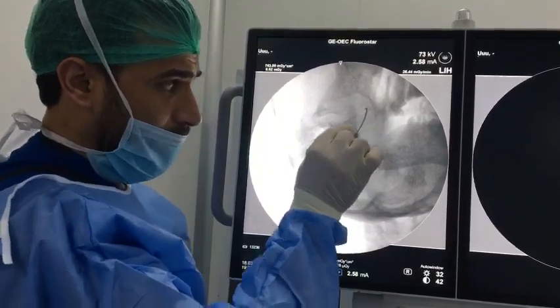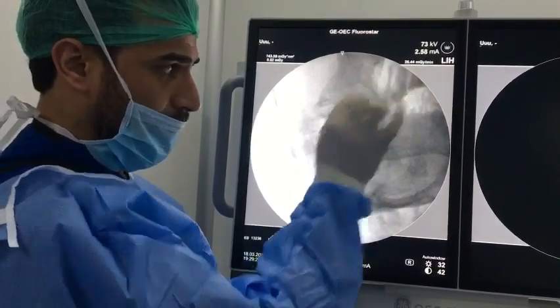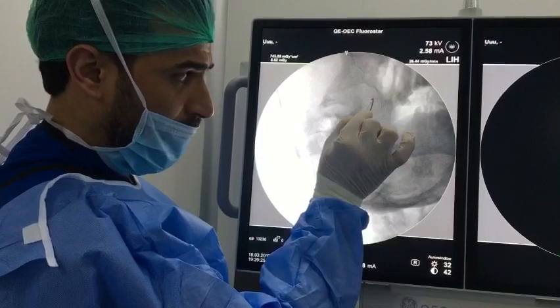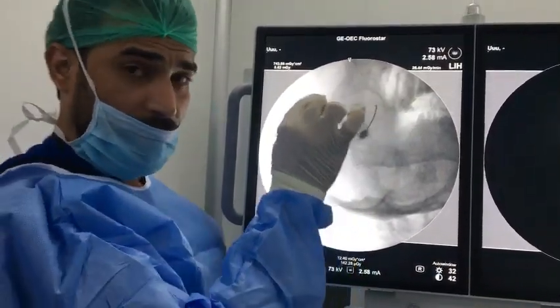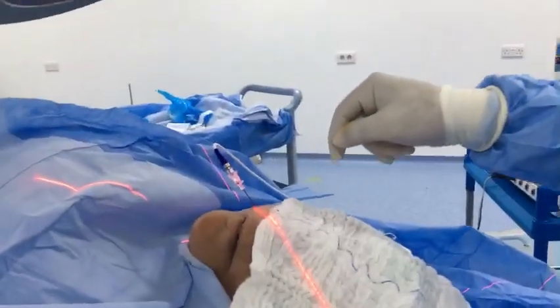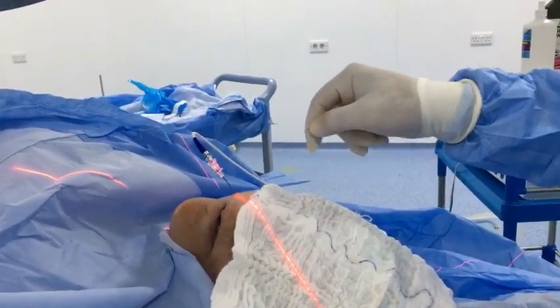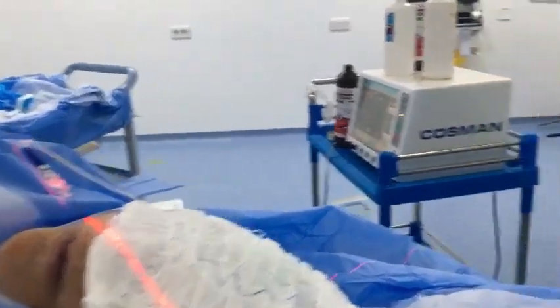See here — this round oval shape, this is the foramen ovale. See the needle: I kept the tip of the needle just inside the foramen ovale. The tip of the RF needle is inside. Here is the lower trunk of the trigeminal ganglion with the mandibular branch, maxillary branch, and ophthalmic branch. You can see the twitching of the digastric muscle and the masseteric branch because of stimulation of the mandibular branch with pulsed radiofrequency.